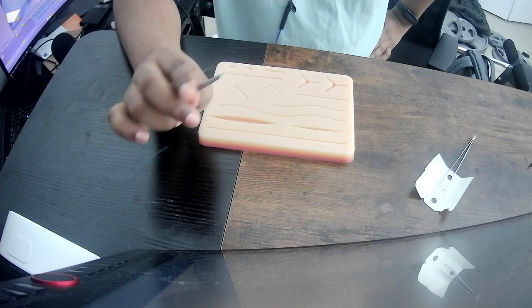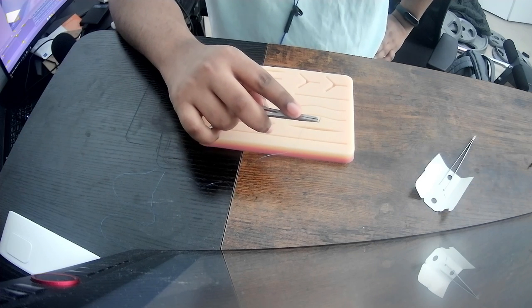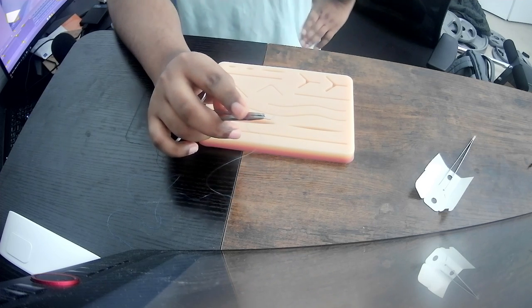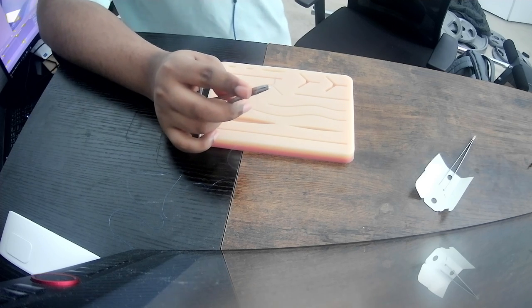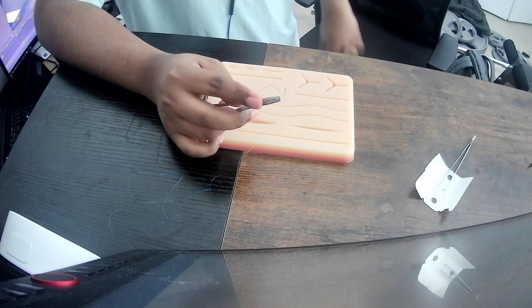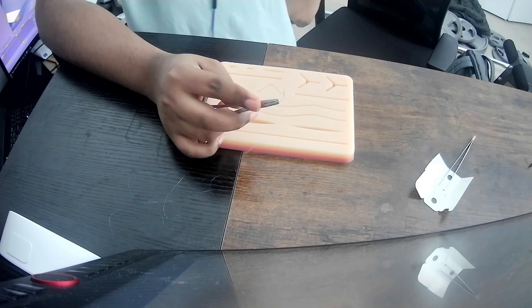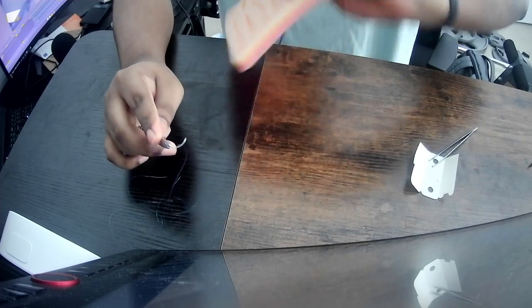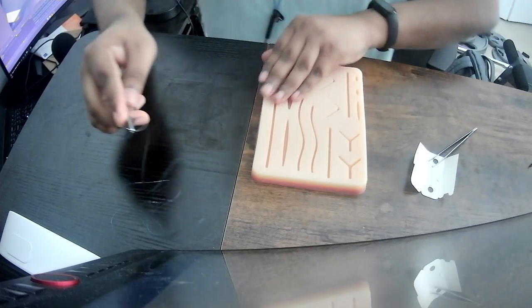Find time within your day where you can just practice manipulating the needle through something. Quite frankly, the hardest part isn't actually working with the skin. It's driving your needle through something, picking it up on the other side, and then using the tools within the confines of having to suture something. That is what you have to make muscle memory, and it's very hard to do that with pig's feet because it's just not easy to do in very high volume, nor is it practical.